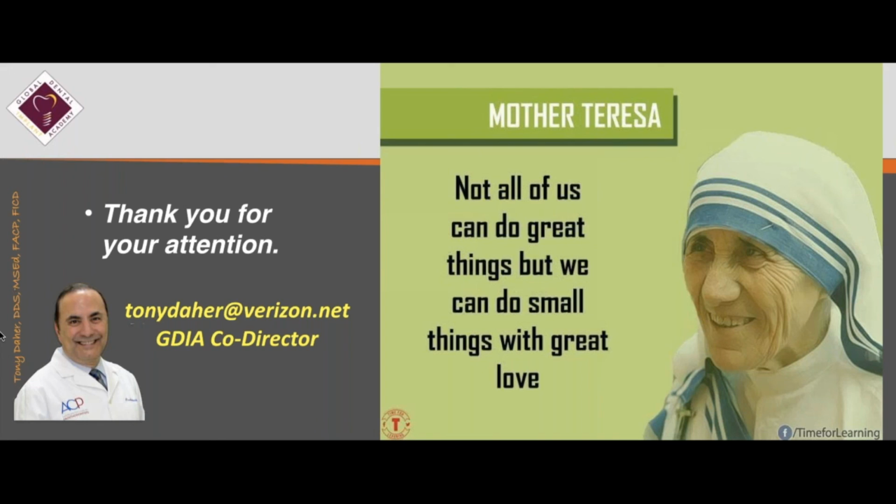We know for a fact if you use a threaded implant with a rough surface, usually 8 millimeters is acceptable, but certainly if you have more bone height, then you can make it up to 10, but 8 is acceptable. Remember, as I said, implants are going to help the biomechanics of your prosthesis. So aesthetics and function and occlusion are as important as the length of the implant.